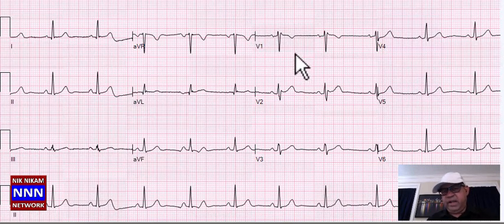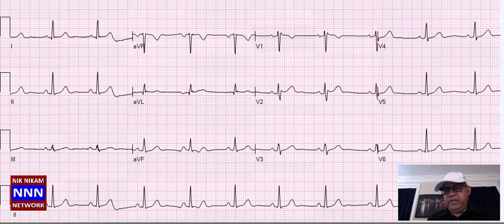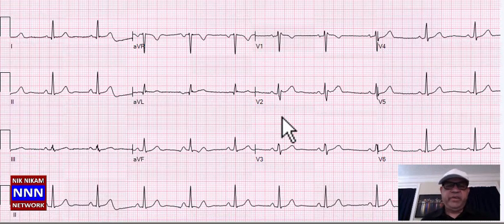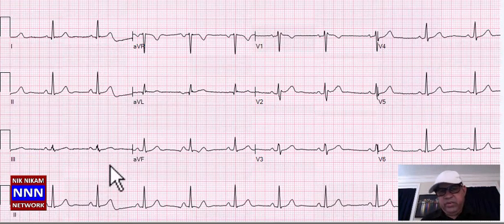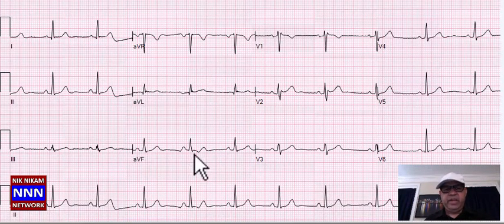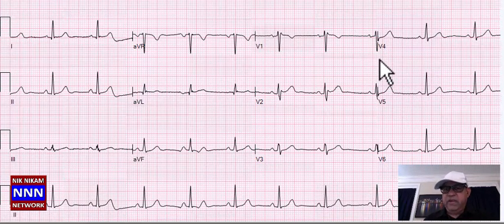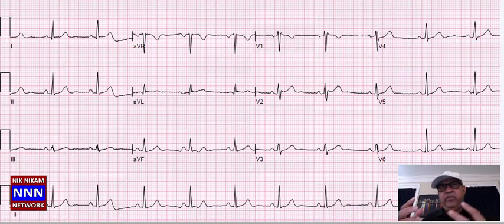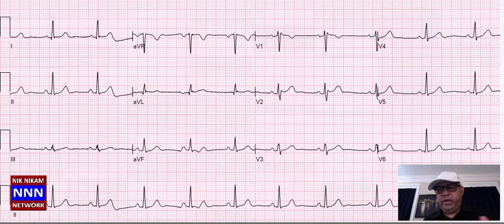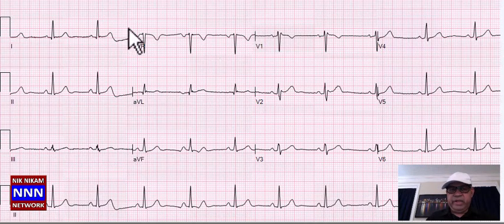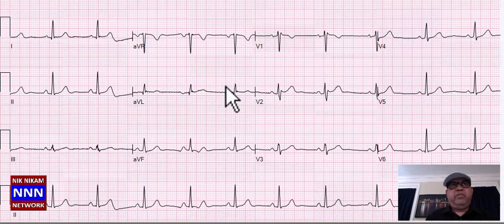Now we have another sinus rhythm with incomplete right bundle branch block, some T-wave changes in the anterior and lateral leads. An important point: when reading an EKG, you look at regions — leads 1 and AVL are high anterior, 2-3-AVF is inferior, V1-V4 is anteroseptal, V5-V6 is lateral. Whenever there is a problem, it occurs in a given region supplied by a particular artery. Group your thoughts by inferior wall, anterior wall, lateral wall, and high anterior — just three or four areas of the heart.